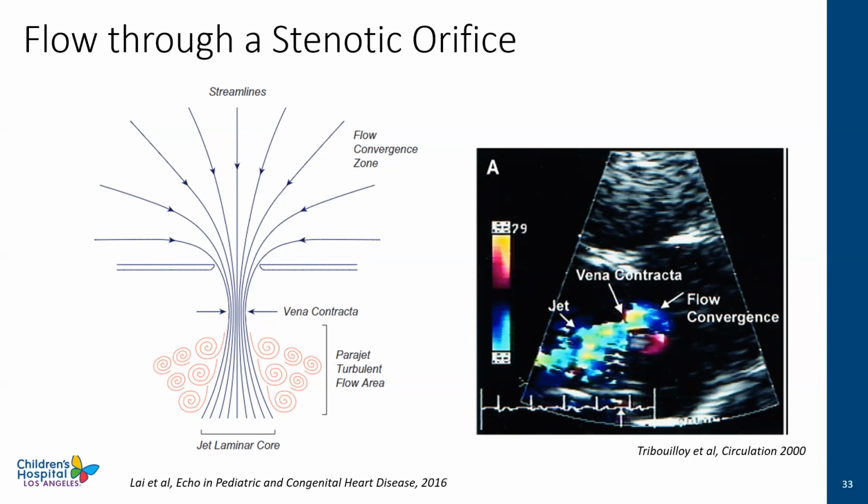And so it's going to be important to understand these flow patterns, to understand the limitations of what we can assess across a stenotic orifice.